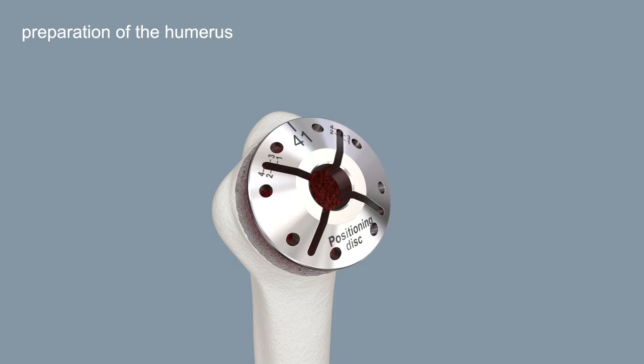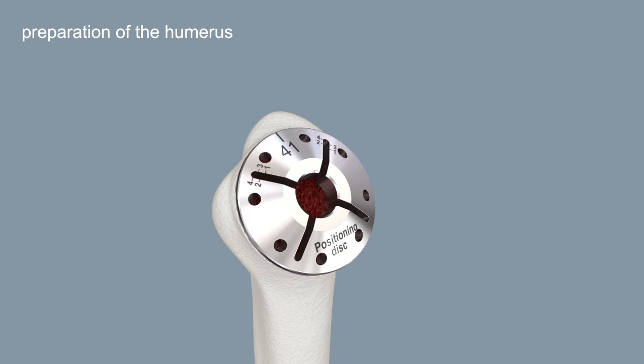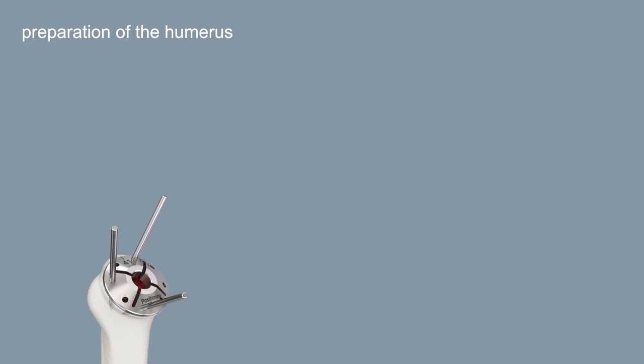The laser marking with the head size indicator should be positioned laterally at the 12 o'clock position. Fix the positioning disc with at least three 3.2 mm pins.